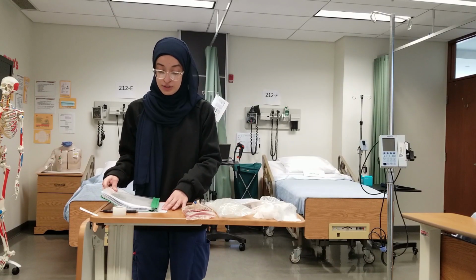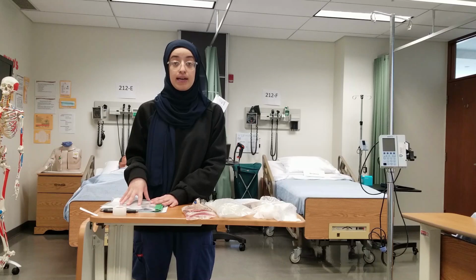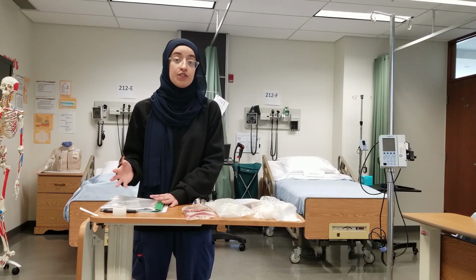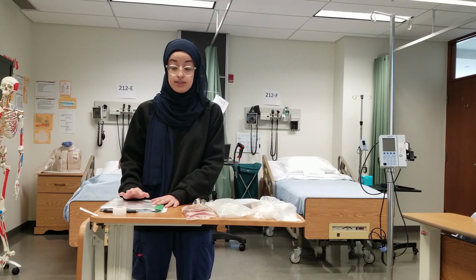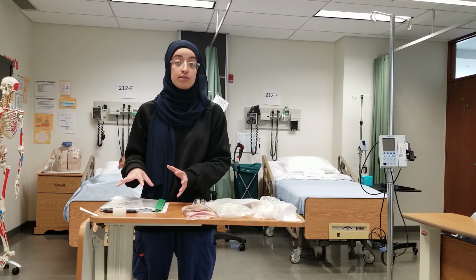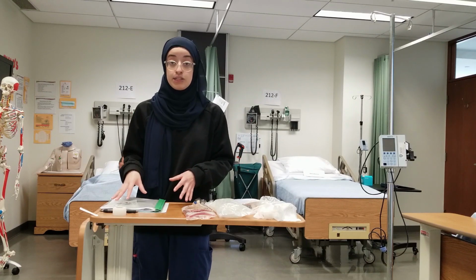Next thing that I'm going to do is compare and check the MAR to see if there are any medications. Sometimes before a patient receives blood products, we might be giving them some medications. For example, in the case of GI bleeds, sometimes physicians will order pantoprazole to reduce the incidence of any ulcers for the patient. So we want to make sure that there aren't any medications that need to be transfused first, because once we infuse the blood, sometimes they aren't compatible, so we don't want to be giving or withholding that medication from a patient beforehand.